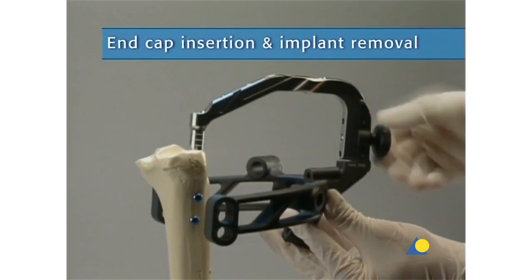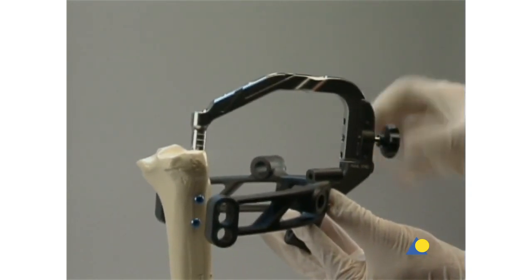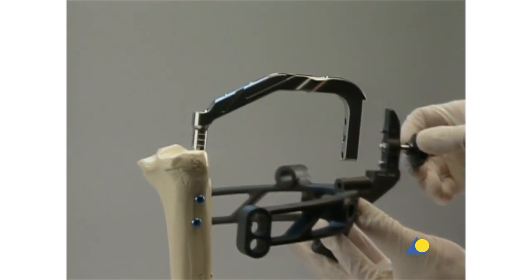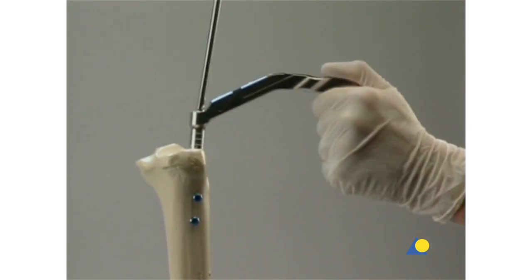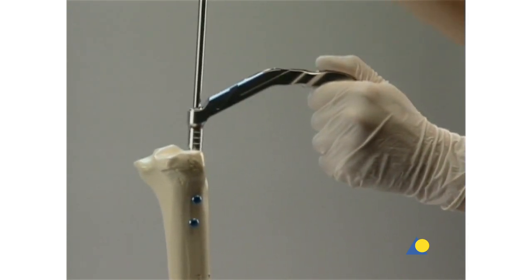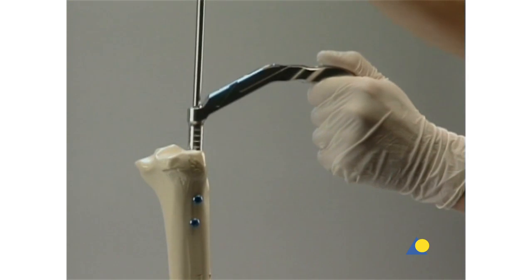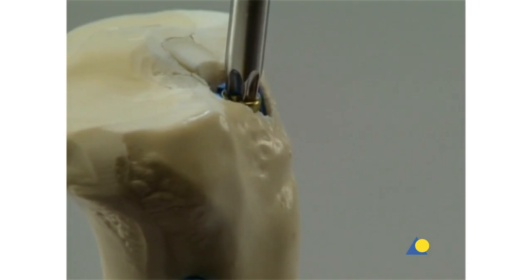The end cap prevents bone ingrowth into the proximal end of the nail, making nail removal easier. The patient's leg should be positioned in flexion to assure enough space to insert the end cap. The aiming arm, the connecting screw, and the insertion handle are removed. The end cap is inserted into the nail with the screwdriver and firmly tightened.